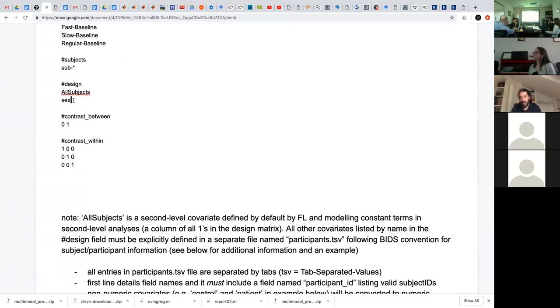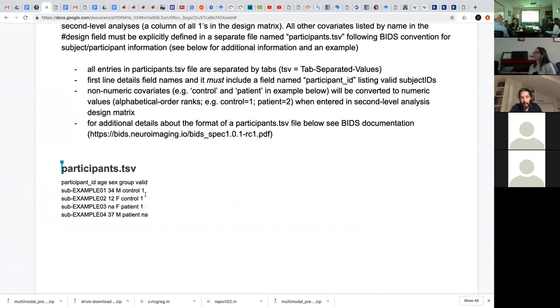When you have more than 2 groups, they don't work in the same way. If you have patients, controls, and family or something like that, it's best to specify 3 different groups instead of 1 single group covariate with 3 levels, because when you specify 3 levels of a categorical covariate, it assumes that the levels are sorted, right? You do that when you have ordinal categorical variables where the order matters. But typically when you have groups, you don't care about the order of those groups. You think of them as nominal categorical variables, and for that, it's best to dummy code them.